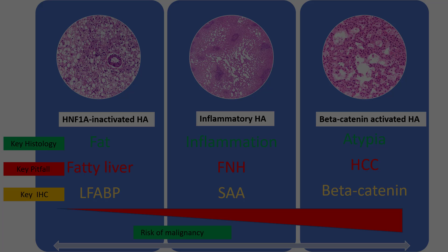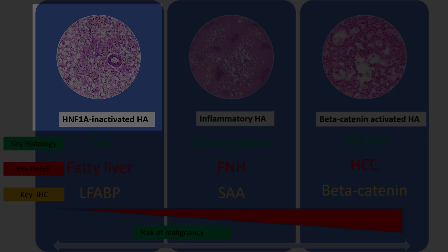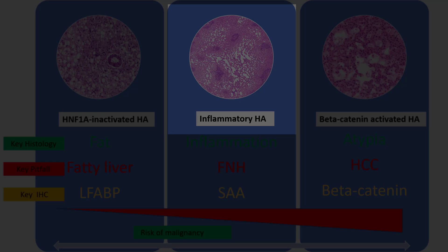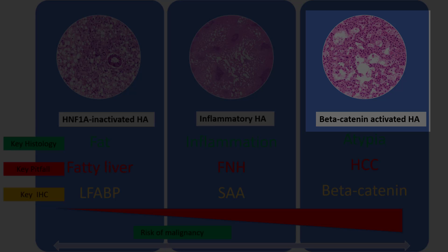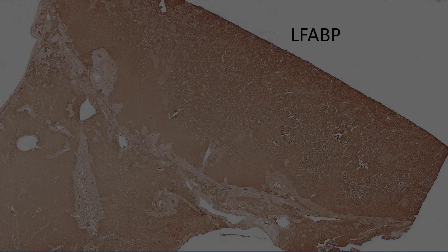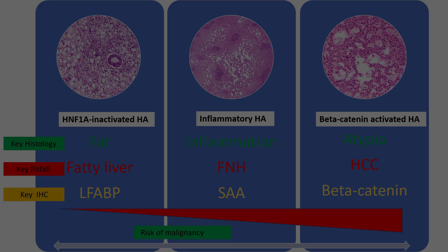So first things first: classification of hepatic adenomas. There are broadly three types. The HNF1-alpha-inactivated adenomas, which I prefer calling fatty adenomas because they show fat; the inflammatory adenoma; and the beta-catenin-activated adenoma. Now this lesion did have a bit of fat, and hence I considered a fatty adenoma. The key immunohistochemical stain is LFABP, and as you can see here, the LFABP is intact — that essentially rules out a fatty adenoma.